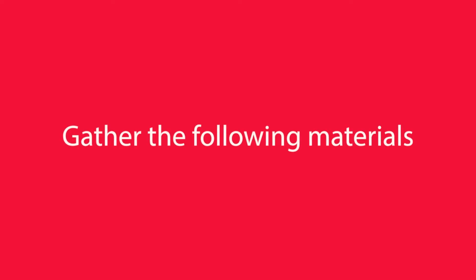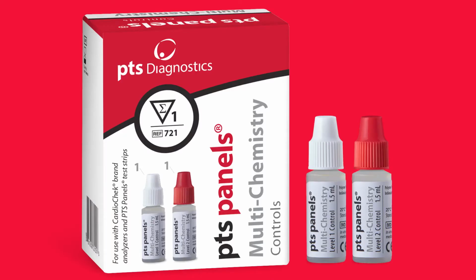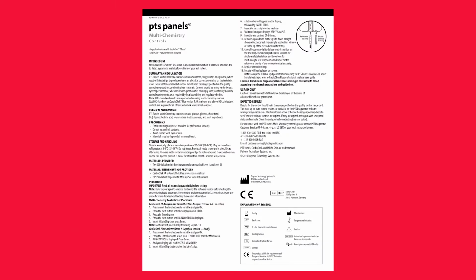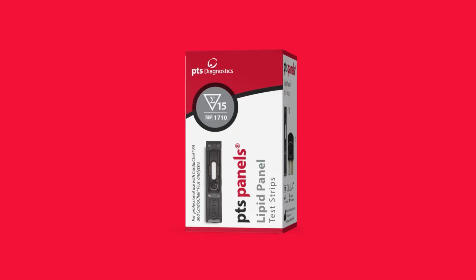Then, gather the following materials: the CardioCheck Plus analyzer, the Level 1 and Level 2 multi-chemistry liquid control materials, the quality control instructions, which can be found in the box with your control materials, the quality control range card, which can be found in the box with the control materials or at ptsdiagnostics.com, the PTS panel's test strips and memo chip.